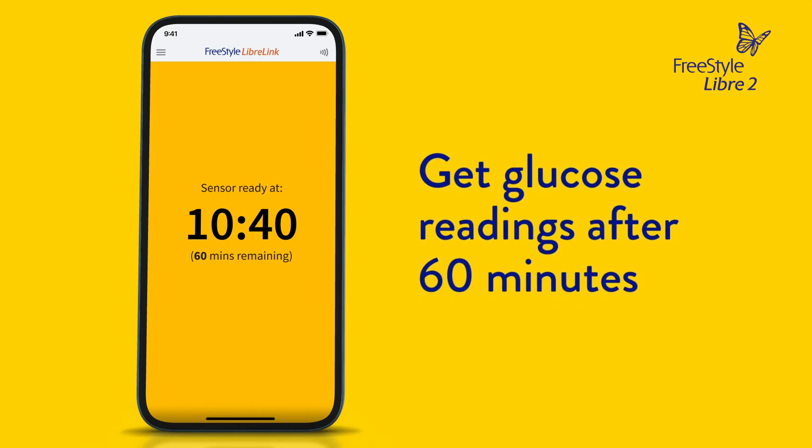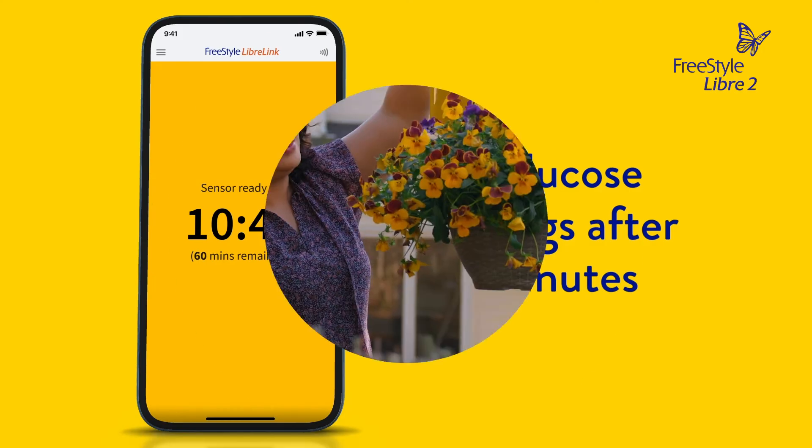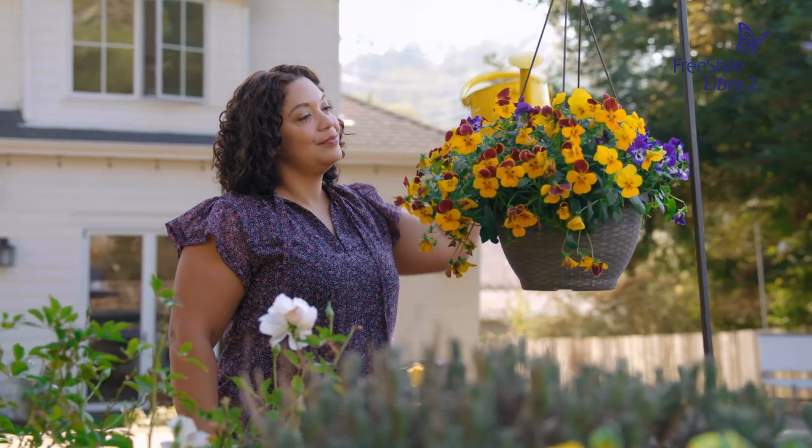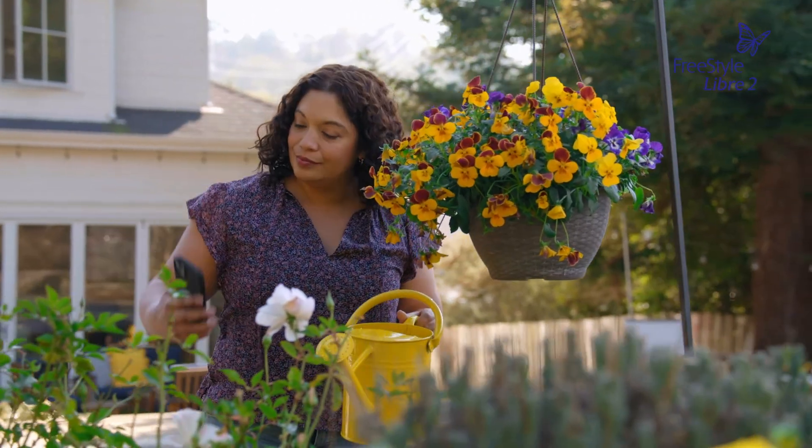After 60 minutes, the sensor will begin sending glucose readings to your smartphone. At that time, the app will offer a quick tutorial of the new features. Using the Freestyle Libre 2 system makes knowing my glucose as easy as looking at my smartphone.